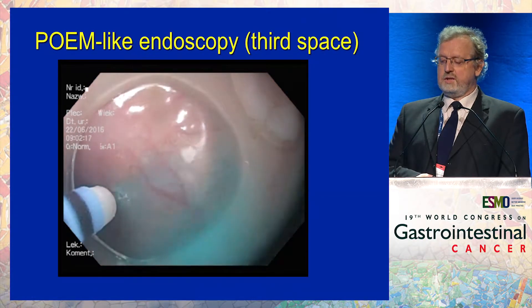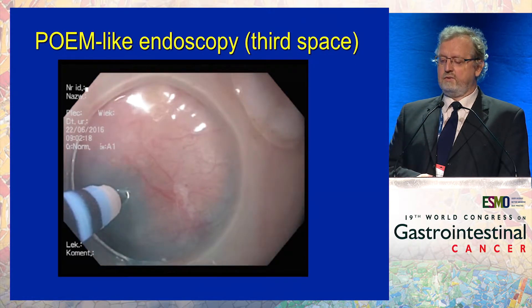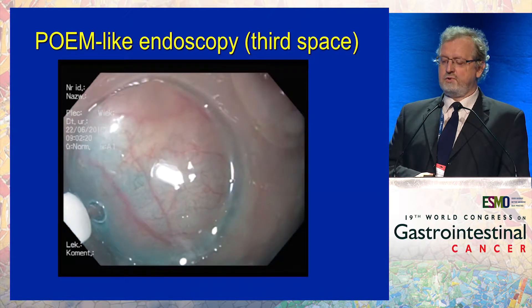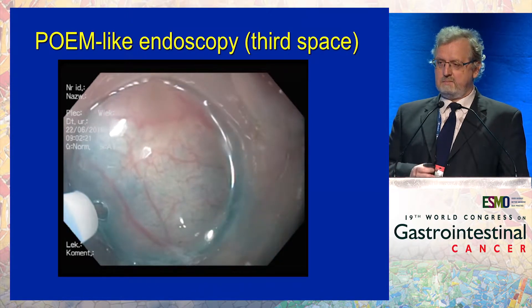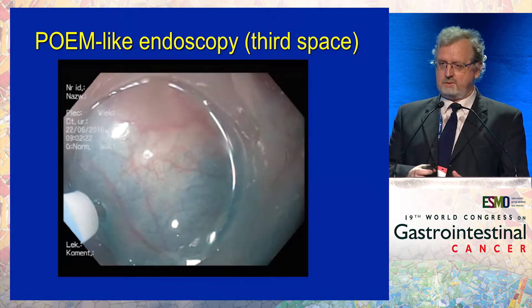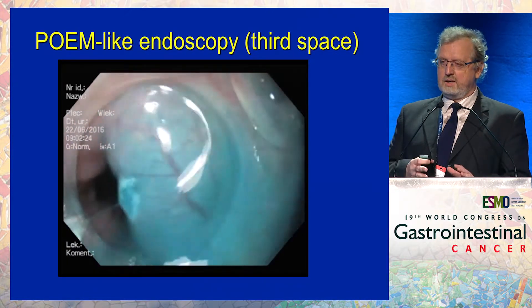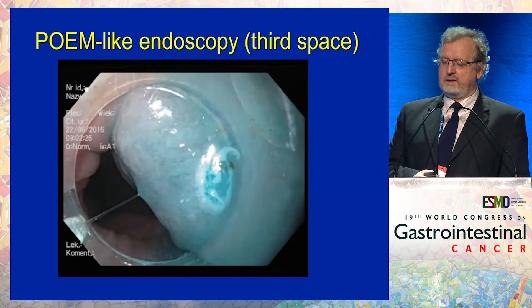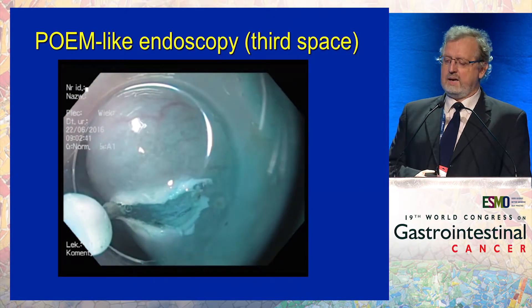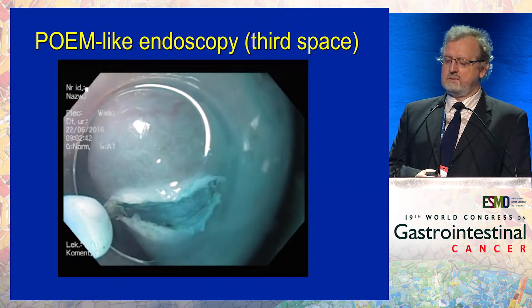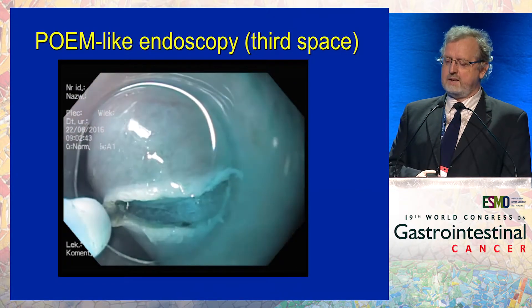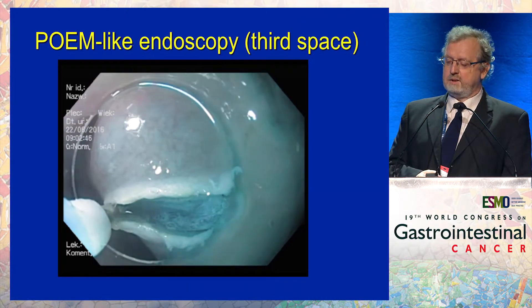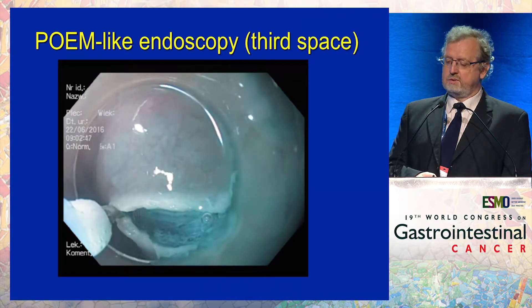We first inject a lot of fluid to make the third space between the submucosa and the muscle layer larger and larger. Then we enter this space by cutting the mucosa in the middle part of the esophagus.